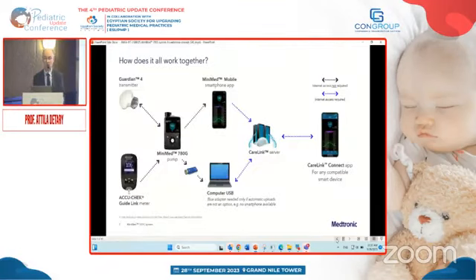So, this is another look at the components so that you understand how the system communicates. The central element is the insulin pump itself. And as you can see, the black dotted line is the Bluetooth connection. So through Bluetooth connection, you connect the sensor and the transmitter. Also, you can link a BG meter. If you do not have this specific BG meter, it can be any other BG meter. The only difference is that you have to enter the BG value manually.